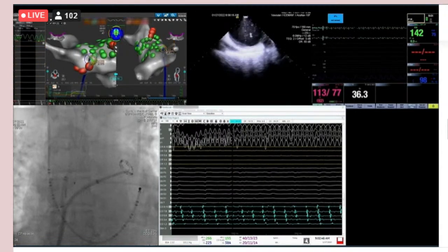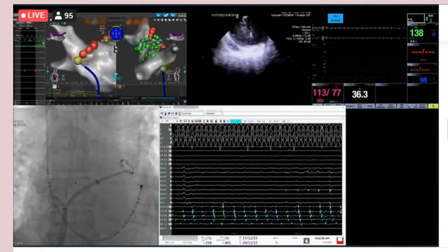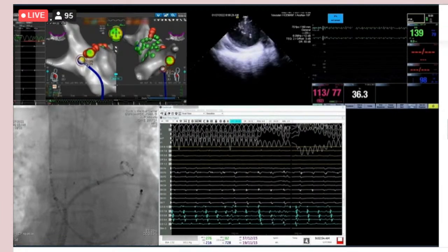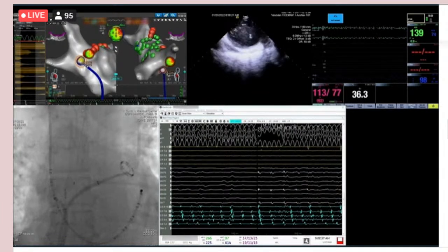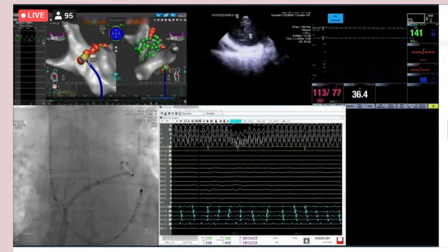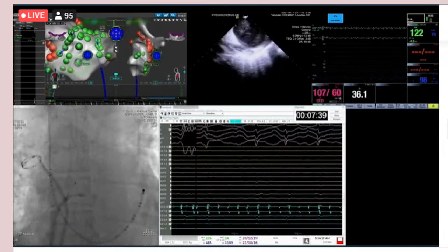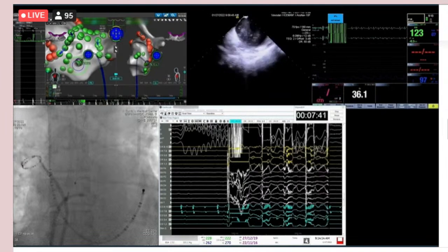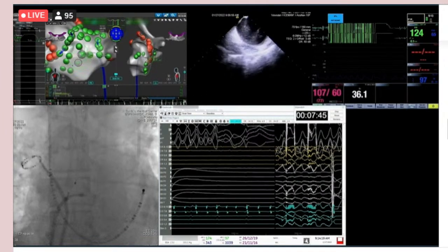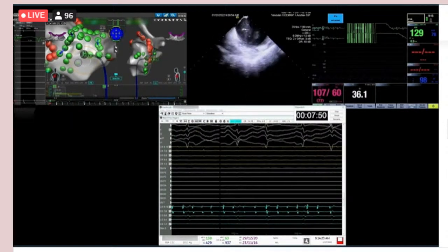From a versatility perspective, it looks like you can get just about anywhere with it, huh? Yeah, you really can. And like I said, in my opinion, this performed really well, particularly for someone who doesn't like bidirectional catheters, and for a first case, not being used to it. This went very fast. I don't have the timestamp on the video here, but after all the equipment was in, and testing the phrenic and things like that, we actually skipped over an important part here.